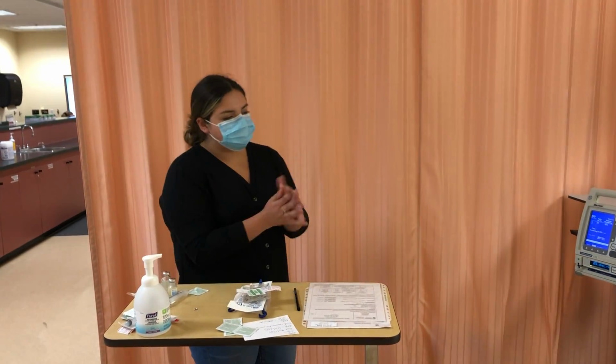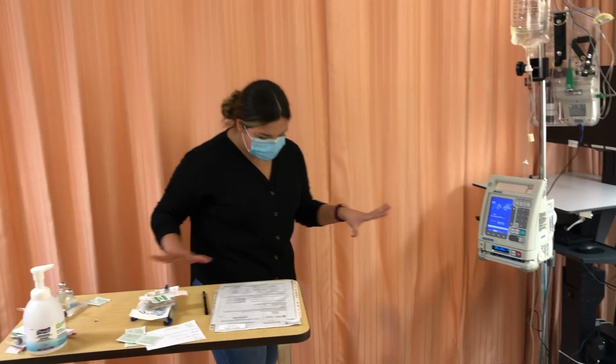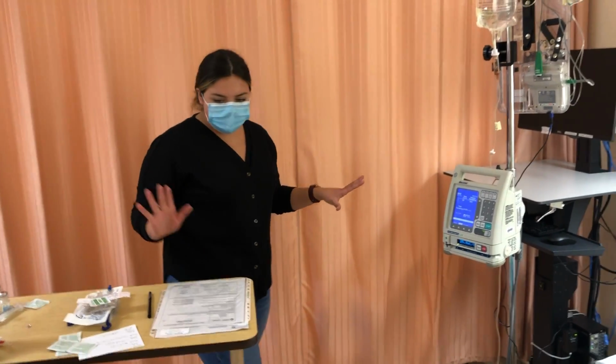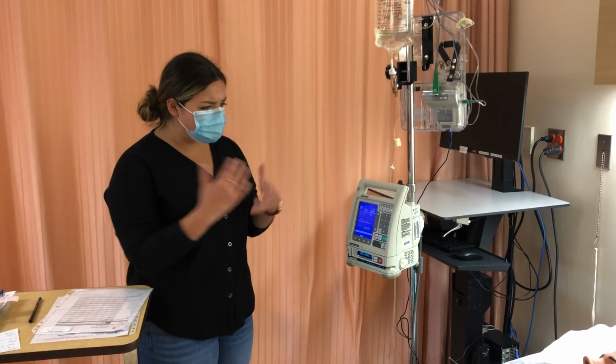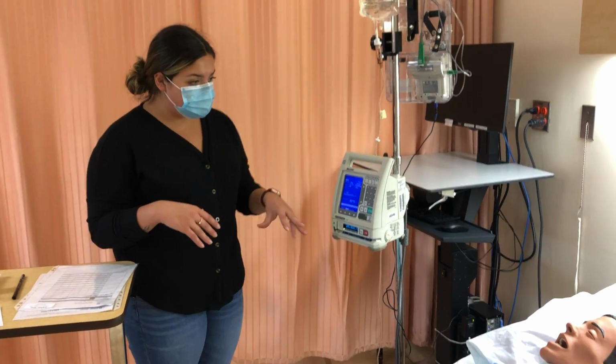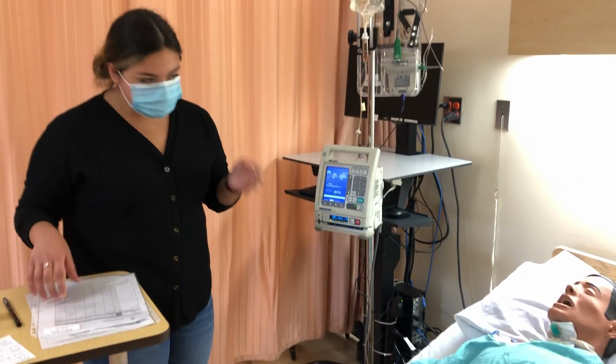So I'm doing hand hygiene as I'm entering the room. Patient is not in distress. My environment is clear and safe. So I'm just going to introduce myself. My name is Kaylee. I'm a student nurse. I'm going to be here to administer your antibiotic through your IV. This is going to be used to treat your cellulitis.